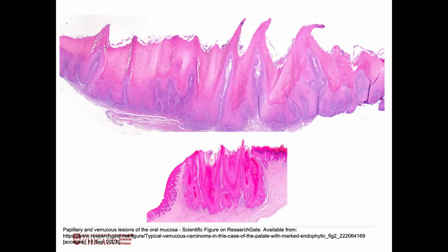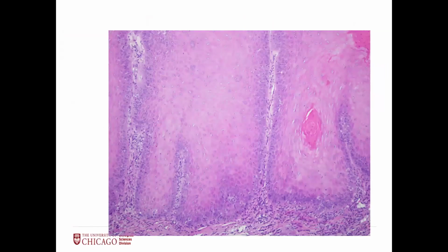Always worries me. Always raises my concern for dysplasia. I would have to have perfection to call it a verruca. Perfect orientation, perfect appearance, perfect situation, absolutely no pushing invasion. I feel it looks so bland.